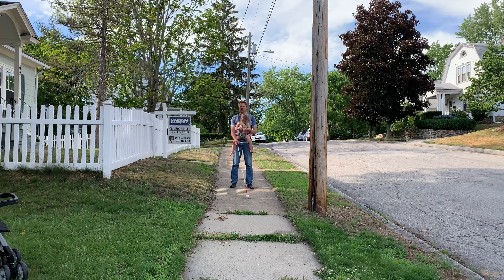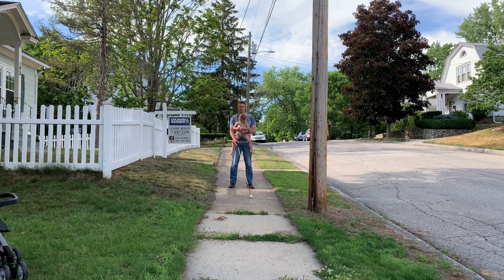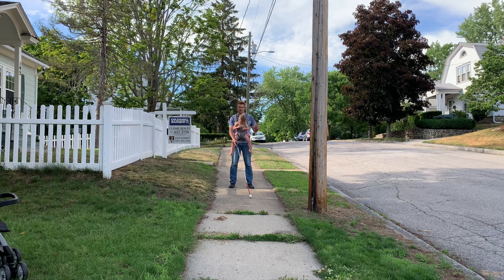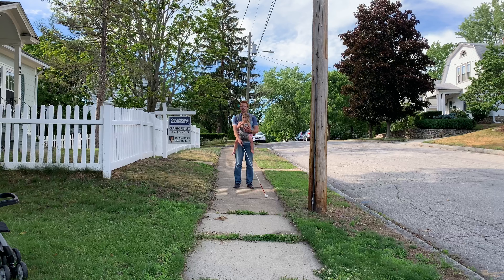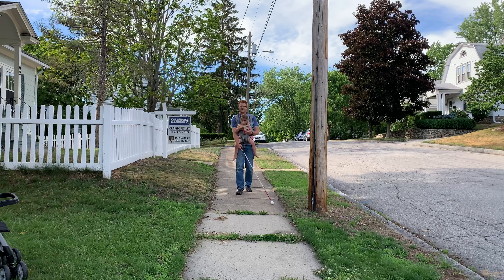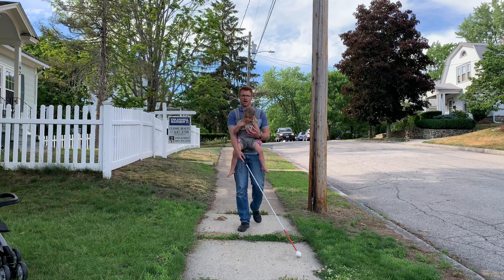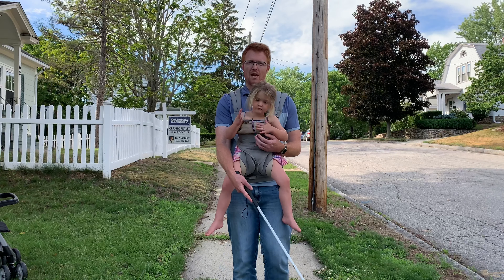This is the first of three alternatives I'm going to share with you, and this is really my favorite one, especially if you can physically do this. Right now I have a child carrier strapped to my chest and a toddler strapped into my carrier. I like this because I'm still able to use my cane and use it to its full capacity, unlike pushing a stroller where the stroller is blocking the cane. My cane is sweeping left and right and still doing a great job of giving me all the warning I would normally get. I really like this as a good way of transporting either a baby or a child.